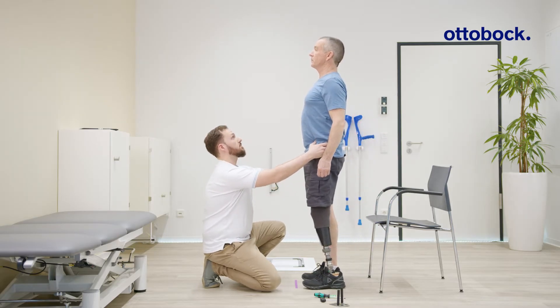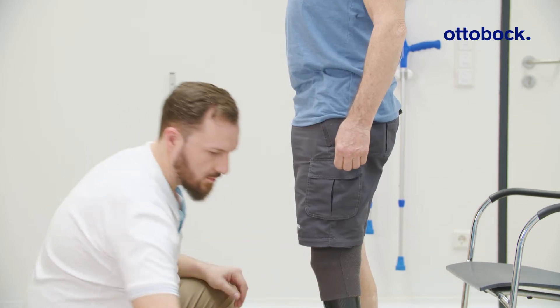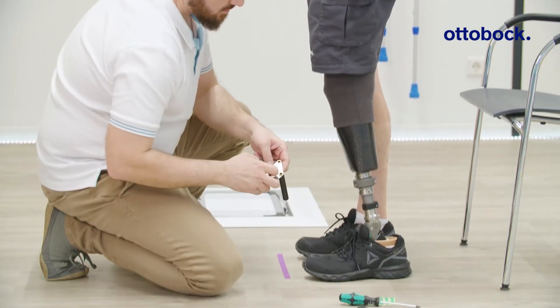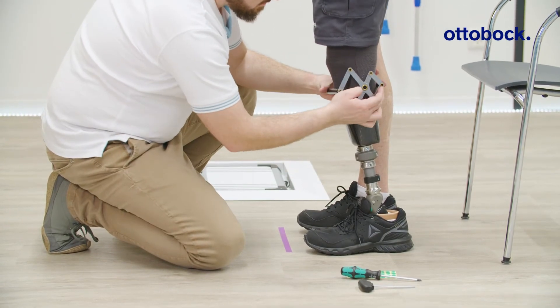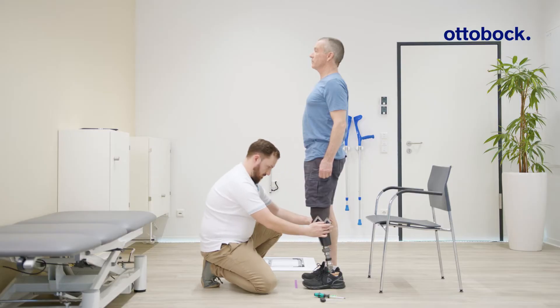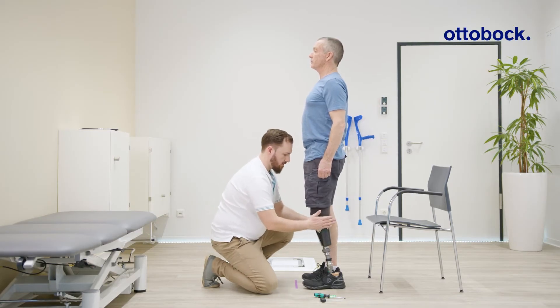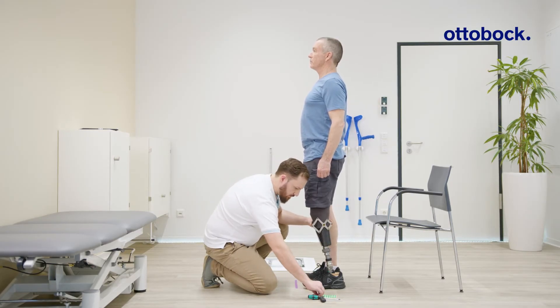If needed, adjust the length accordingly. Then determine the effective knee center of rotation and mark it on the outside of the prosthetic socket.